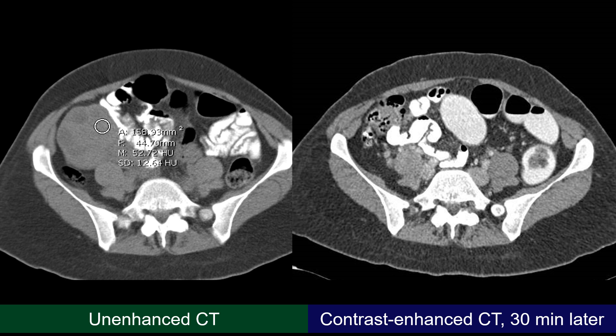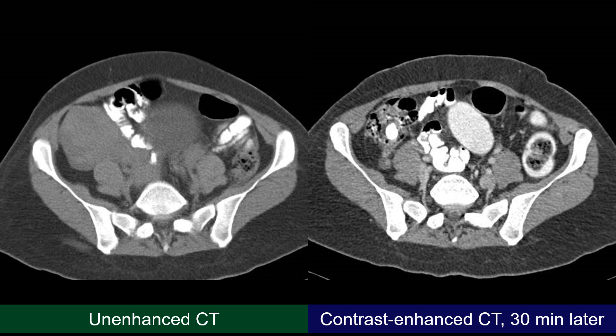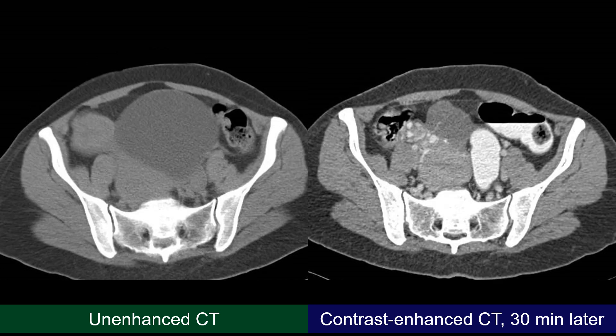But let us first determine the organ of origin of this lesion, because from the start until now we do not see the lesion at the same location on the contrast-enhanced CT. This is the uterus and this is the right horn of the uterus. So this lesion is probably the ovary or the right adnexa.